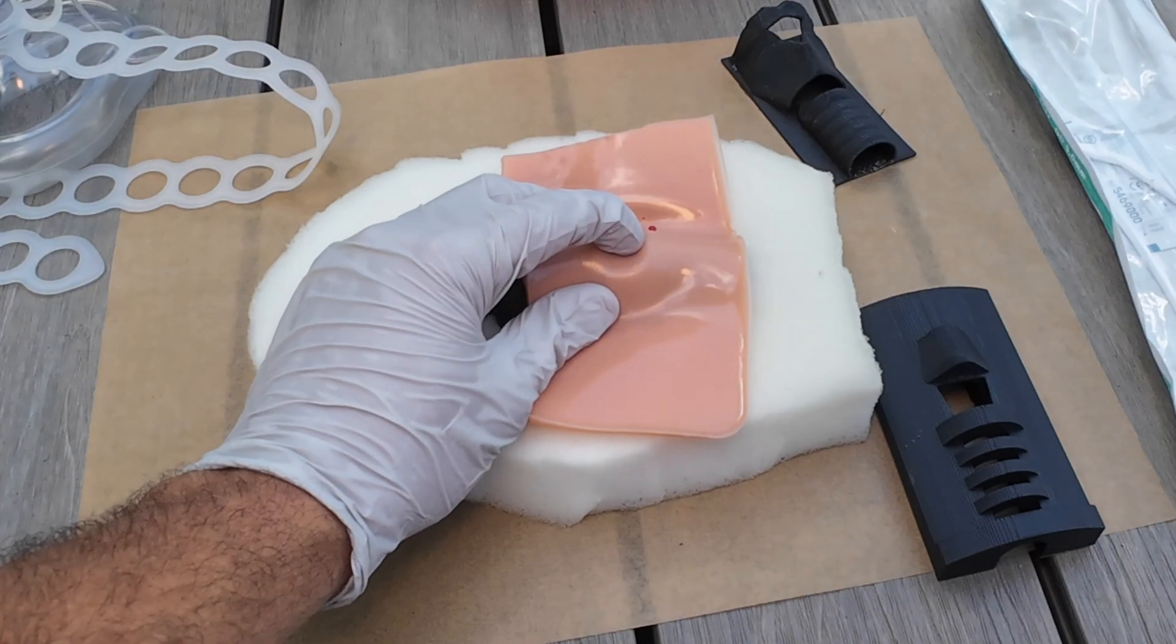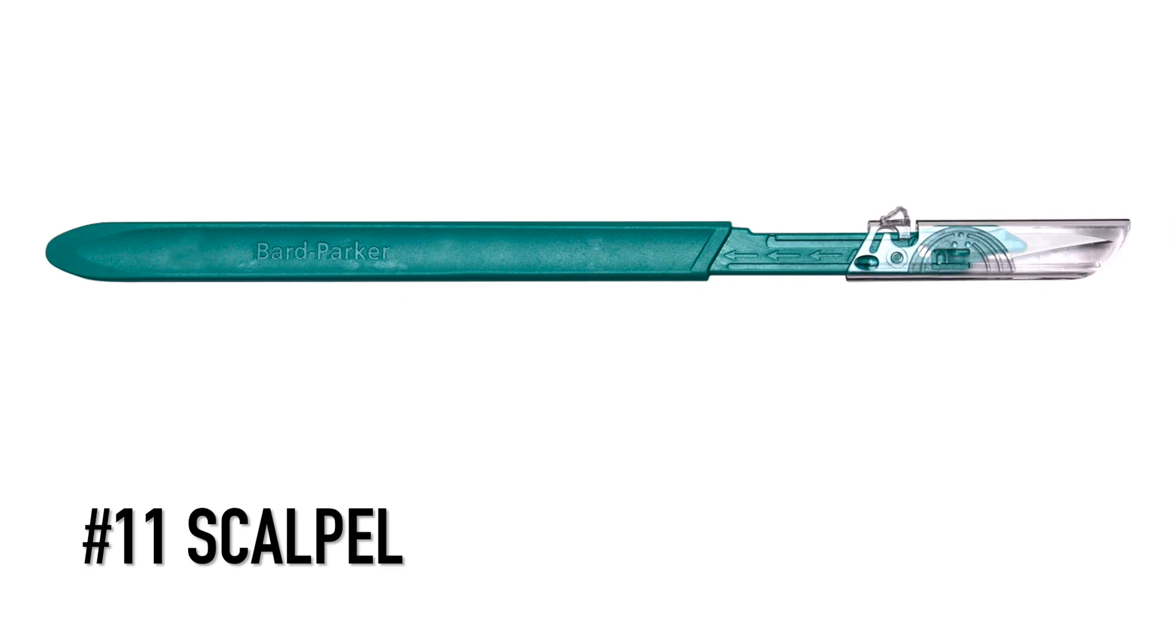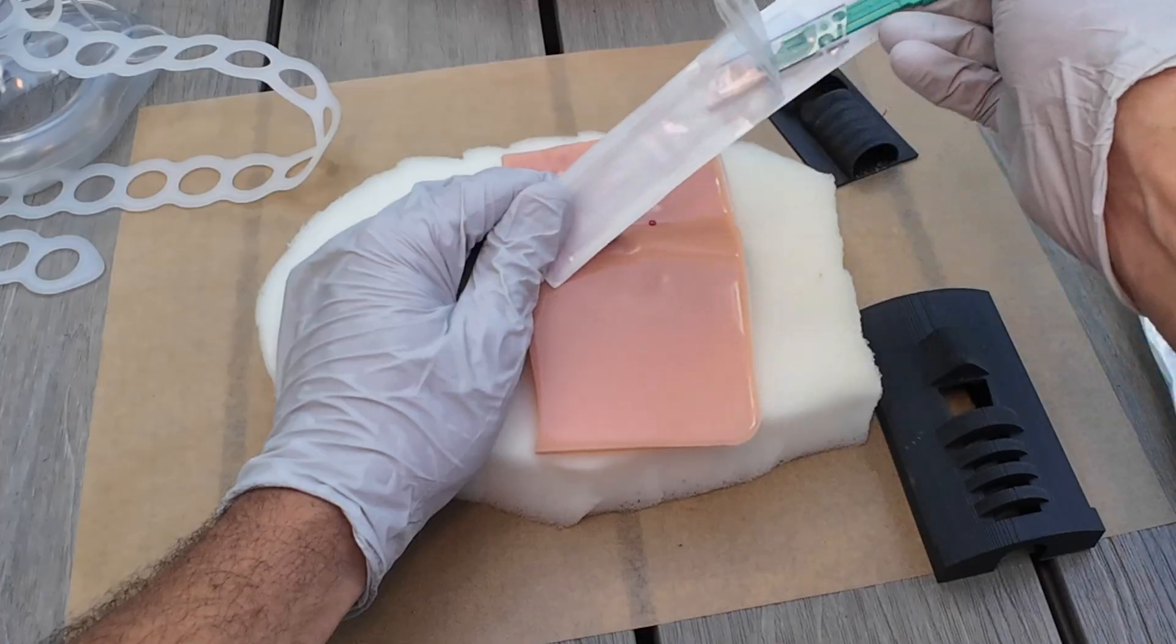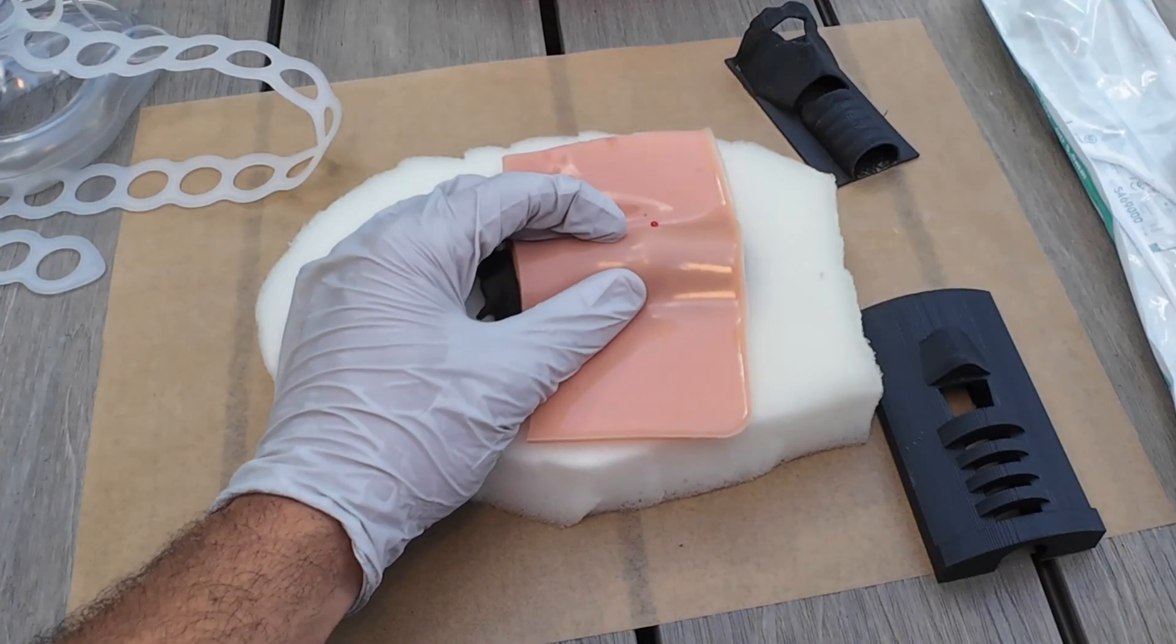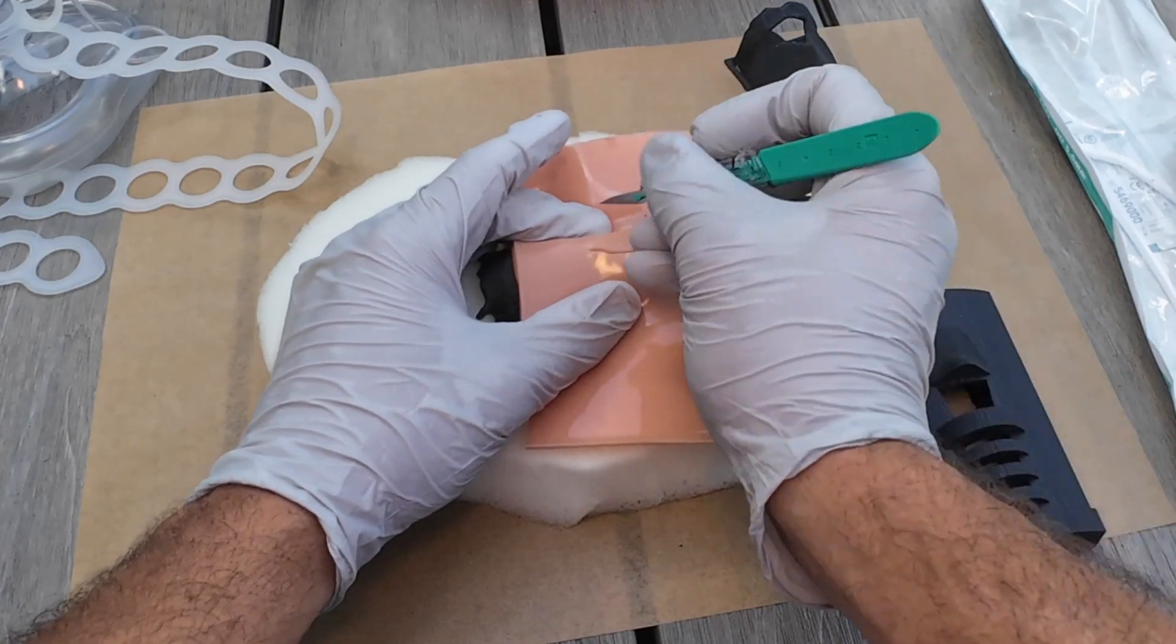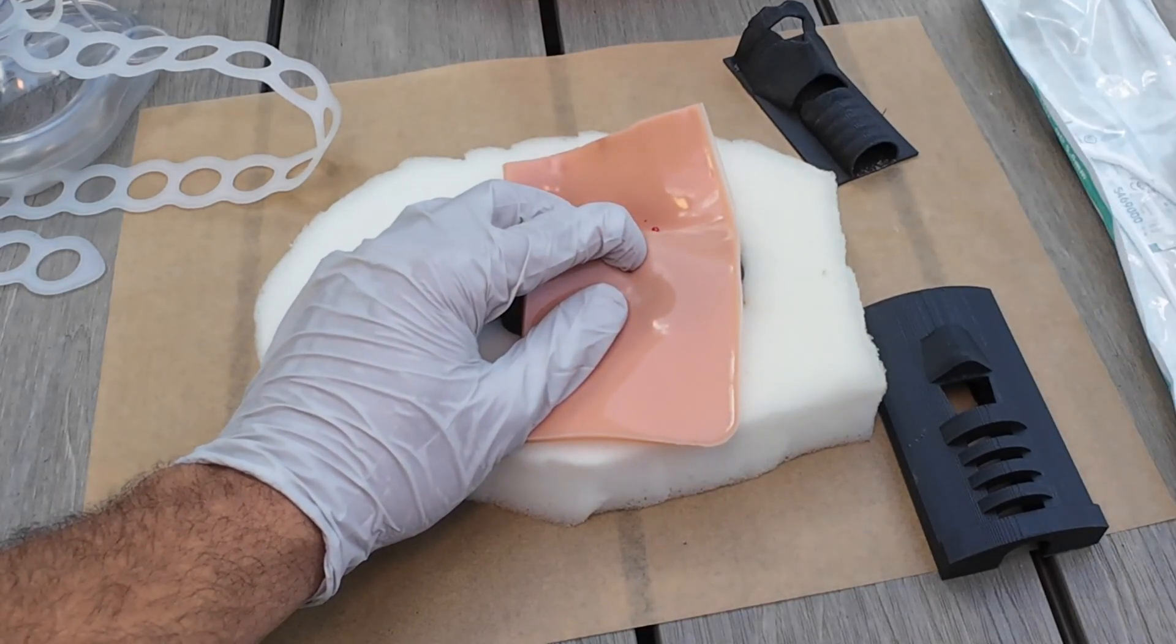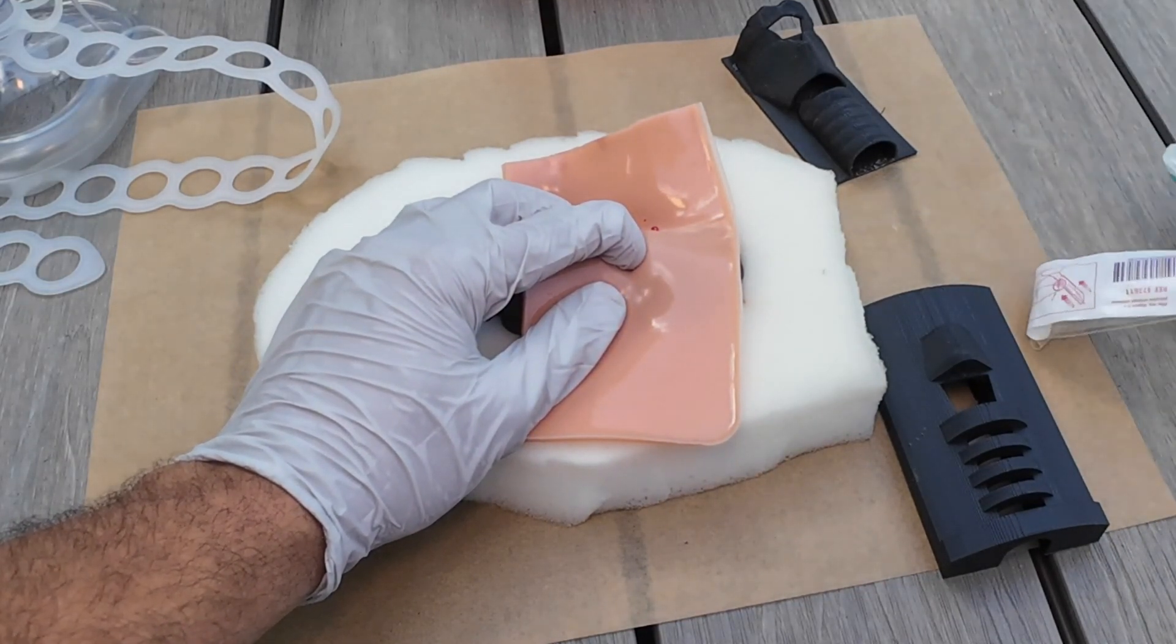Landmark it with my non-dominant finger. Pull my scalpel out. Scalpel's exposed. Cut down. And cut across. Now I hold that hole with my finger. Close my scalpel. Pull my bougie out.